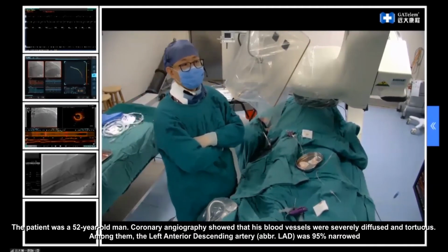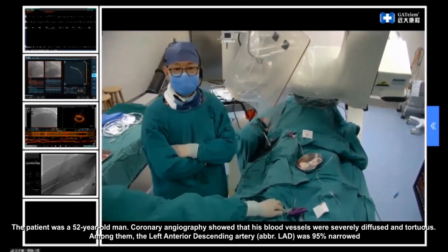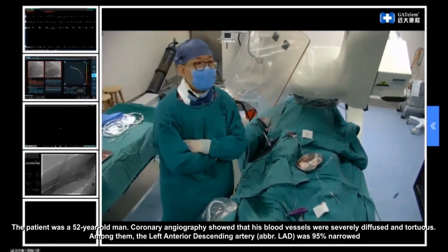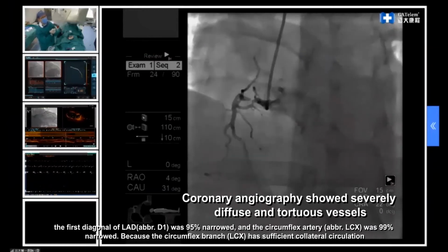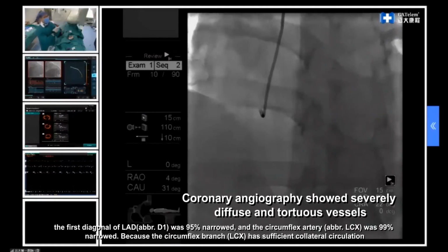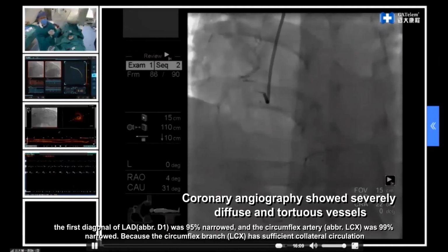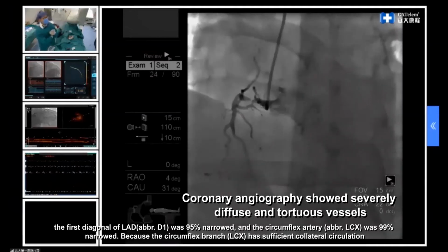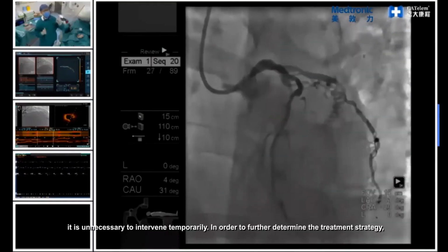The patient was a 52-year-old man. Coronary angiography showed that his blood vessels were severely diffused and tortuous. Among them, the left anterior descending artery, abbreviated LAD, was 95% narrowed. The first diagonal of LAD, abbreviated D1, was 95% narrowed, and the circumflex artery, abbreviated LCX, was 99% narrowed. Because the circumflex branch, LCX, has sufficient collateral circulation, it is unnecessary to intervene temporarily.